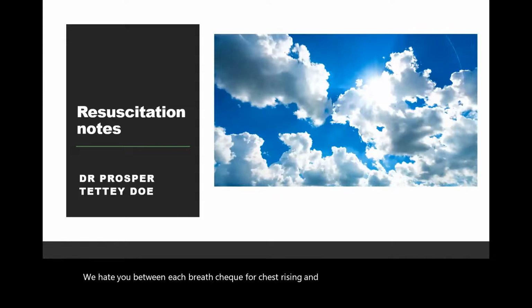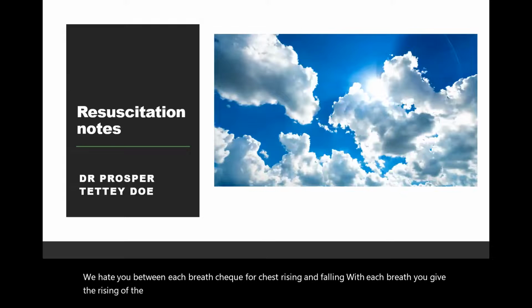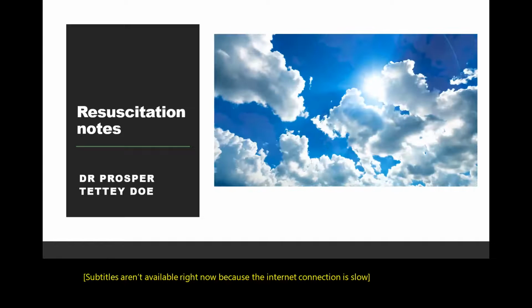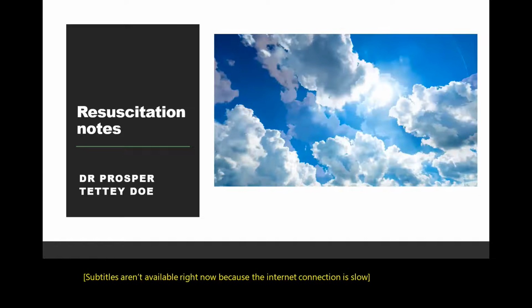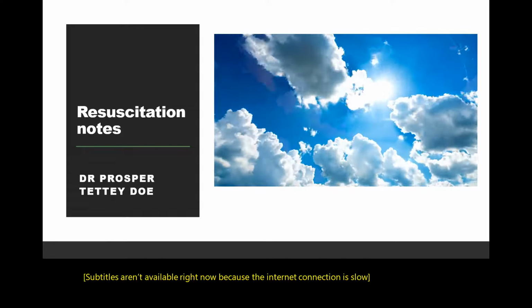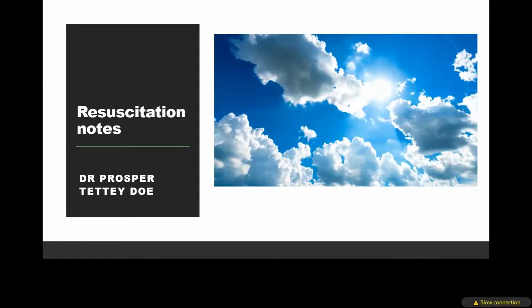Please note, CPR cycles should not be interrupted until a full cycle has been completed or where the casualty is showing signs of consciousness such as coughing, opening their eyes, starting to speak, etc. Continue cardiopulmonary resuscitation, CPR, until an automated external defibrillator, AED, is available, you become exhausted, emergency services arrive on scene, or the casualty shows signs of regaining consciousness and starts to breathe independently.